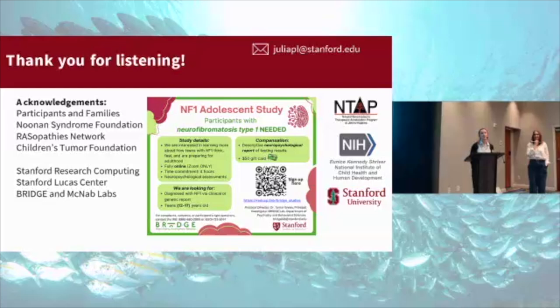So yeah, I think your question is a really interesting one, and definitely one that we are thinking about. My next area of interest is trying to bring all these findings together and see if it's precocious myelination in one area or general delayed myelination, recognizing that each MRI technique itself is a proxy for myelin content and not totally specific, but bringing them together, we might be able to reach some more specific conclusions potentially.